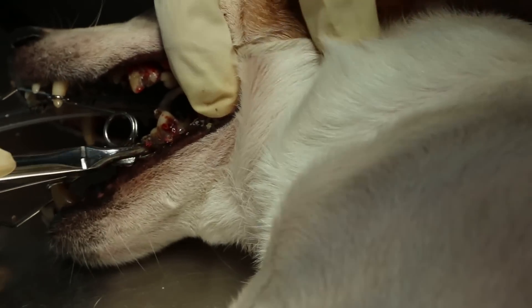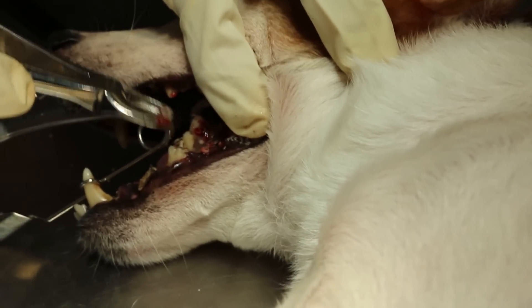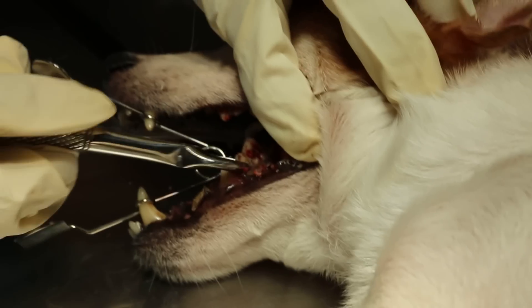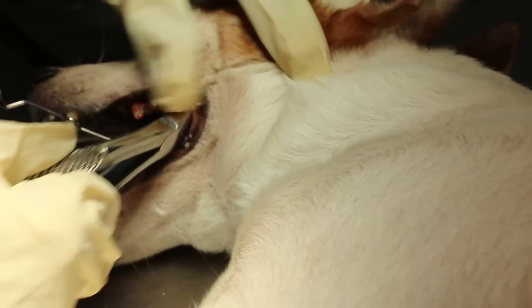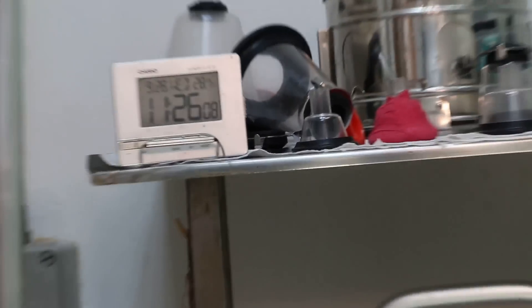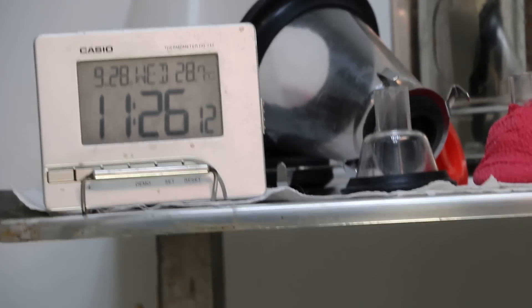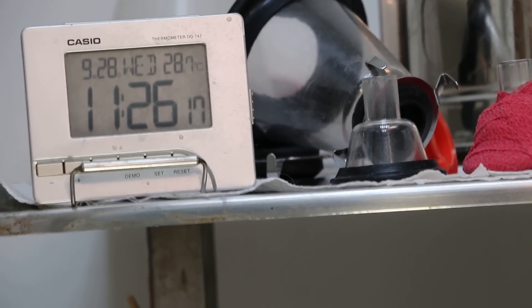To do this side, the person has to go to that side — normally they should face the root. This is the commencement of the dental, starting at 11:21. It's already five minutes gone. It depends on how fast the operator does — it could be 10 minutes to finish everything, or it could be 30 minutes.